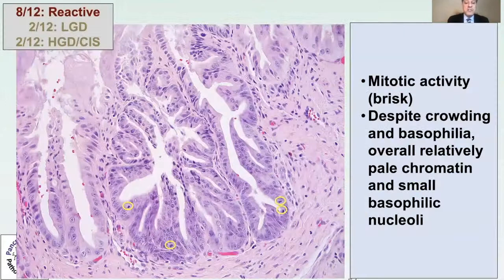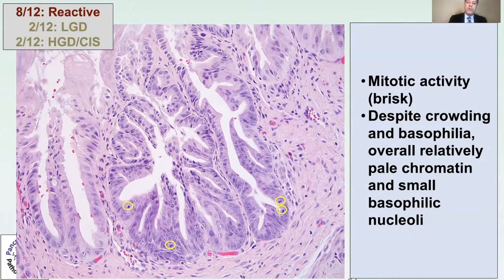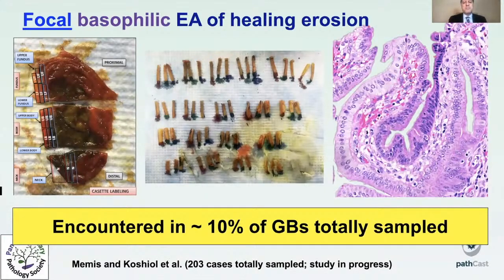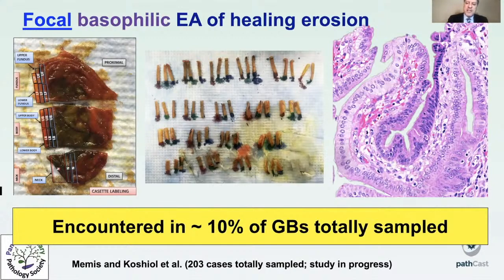Another key criterion: although these reactive areas appear basophilic, individual nuclei are actually hypochromatic with small, basophilic, eccentric nucleoli — unlike dysplasia, where nucleoli are significantly prominent and enlarged. It is almost like the difference between prostate basal cells and prostate adenocarcinoma. Focal basophilic atypia of healing erosion occurs in about 10% of gallbladders that are totally sampled, so this type of regenerative atypia is not uncommon in gallbladders removed for stones and other injury.